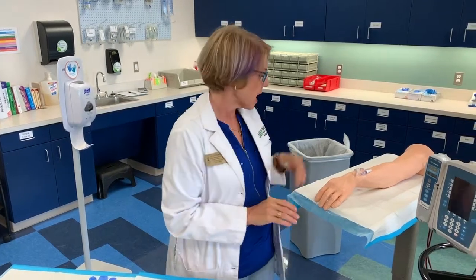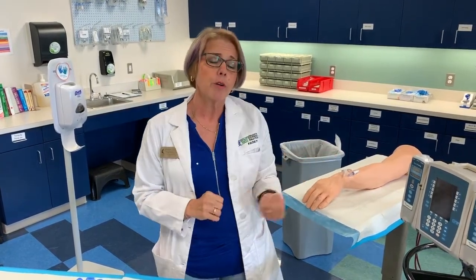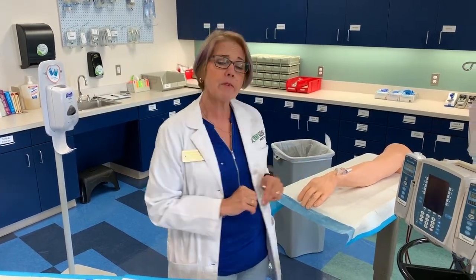Hi, today we're going to talk about starting IV fluids on your patient. So once you have a patient that has an established IV line, or you may have to start the IV on the patient, please refer to that video if you need to go back and review that. But in this patient, we have an established saline lock that we're going to go ahead and start IV fluids on.